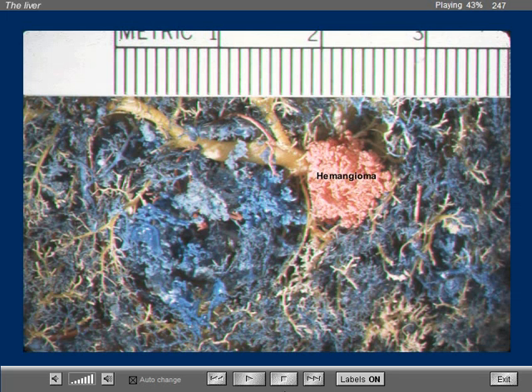These hemangiomas of the liver typically show an opaque ring, and later contrast may be seen within the lesion. This is beautifully demonstrated on sequential CT images, in scintigraphic examination of the liver, as well as on magnetic resonance studies. It is a delayed increase in activity in the center of the lesion that is typical of cavernous hemangiomas. Rarely, a hepatoma may have a similar appearance.